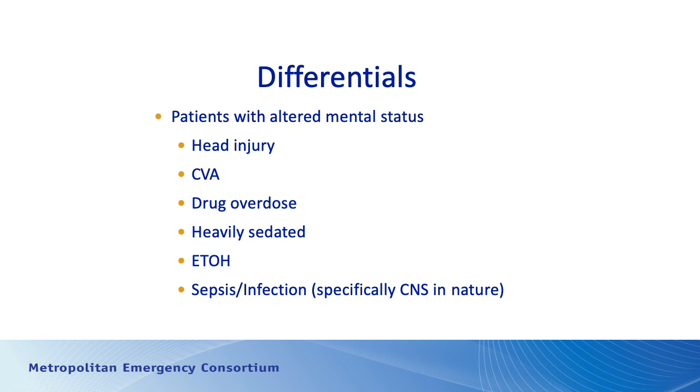So if you look at our process, when we sedate patients to perform a procedure such as reducing a shoulder dislocation, we use capnography to monitor the patient's respiratory status because capnography is a more sensitive indicator of hypoventilation than pulse oximetry. Typically, it will take a normal patient 4 to 7 minutes to become hypoxic with sedation, whereas if we overly sedate a patient, we will see a change in waveforms on capnography almost immediately.